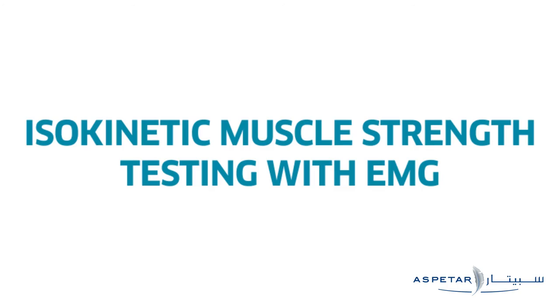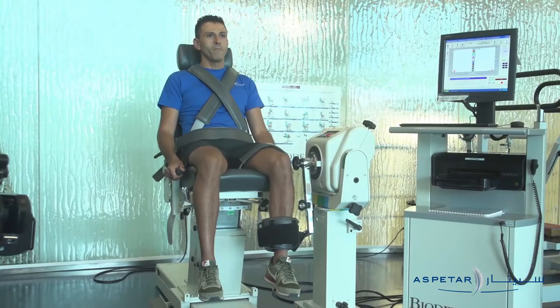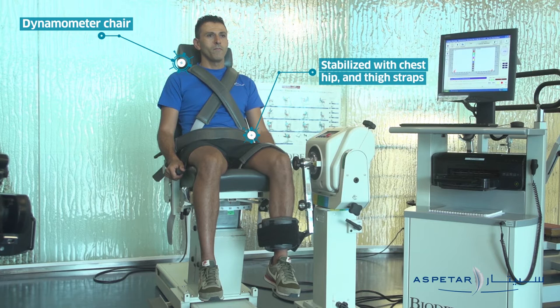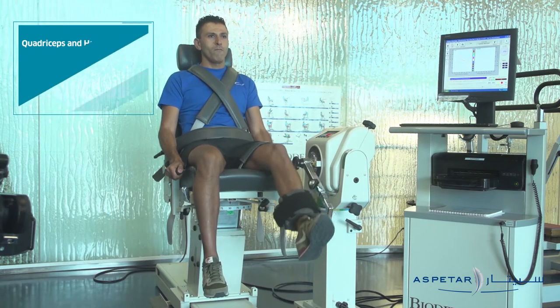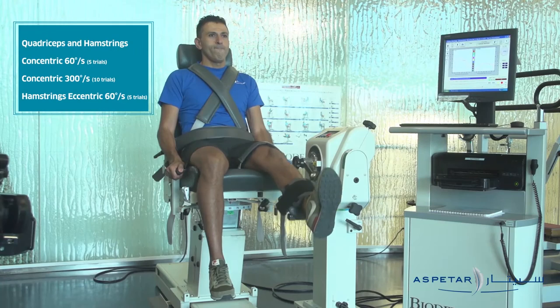Isokinetic muscle strength testing: the patient is seated upright in the dynamometer chair, stabilized with chest, hip, and thigh straps, and instructed to grip the chair handles throughout the test. The axis of knee rotation is aligned linear to the lateral femoral condyle.